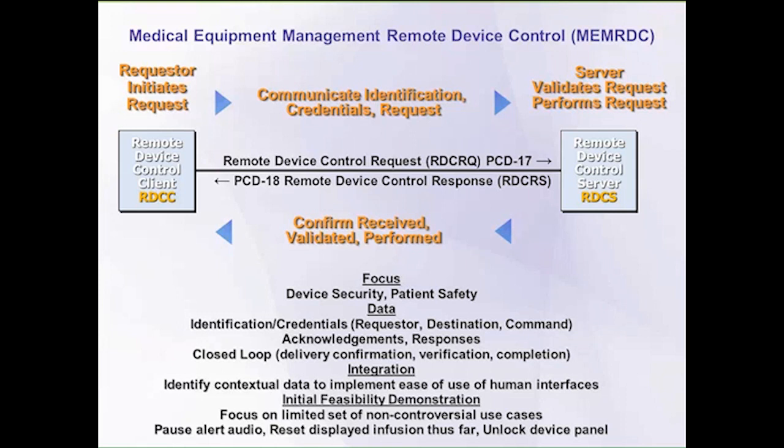That's not stopping the alert. That's not canceling the alert. That's just saying, as if you walked up to the device and you said audio pause, the alert is still outstanding. You still have to resolve it. But if you happen to be a clinician that receives via the ACM profile a notification on your mobile device and you're down the hall, you'd like to reduce the noise in the care unit by silencing it, but leaving the alert active so that you can ultimately still have the accountability to resolve the issue. So that's the idea of the pause audio alert.